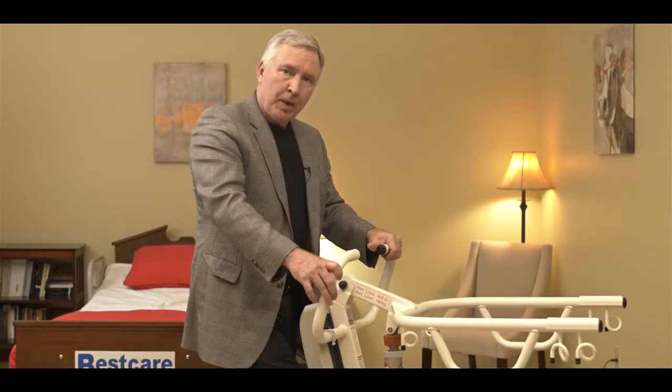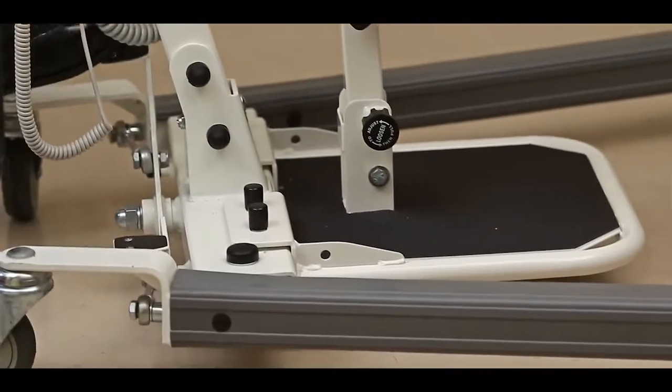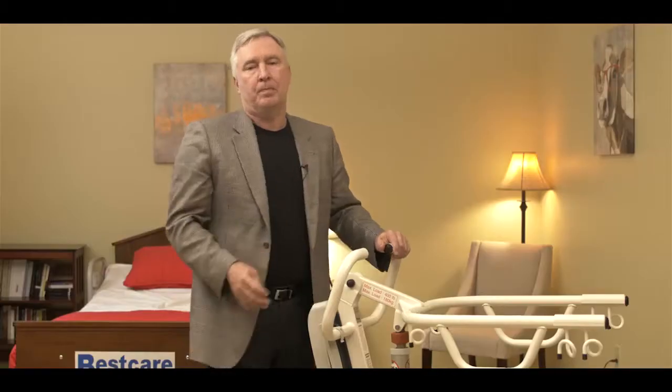The base opens and closes with a foot pedal. Pushing it one direction opens the base; pushing the other direction closes it. We'd open up the base to get around a wide piece of furniture or wheelchair, and close it back down to make it easier to roll around in the room when the patient is in the lift.